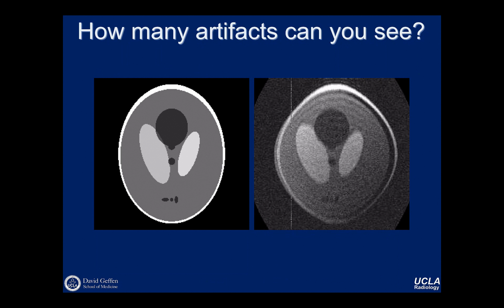Imagine that really bright ring is fat. When fat shifts to the right, it just leaves a void, right? There's nothing else to fill in this gap over here. The fat went to the right, but it just moved away from the underlying water signal. And on the right-hand side, you can see the fat just superposes with the water signal and adds up. So that's a possible artifact, but because I know how I made this, it's not specifically what's happening.